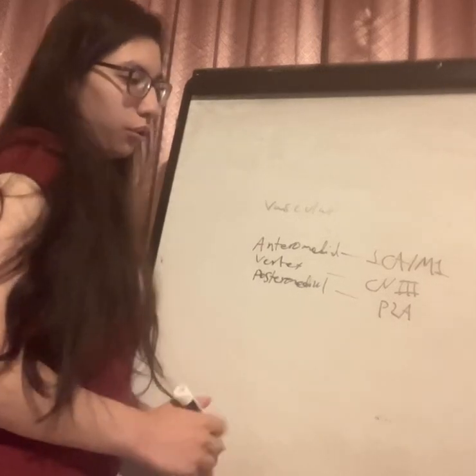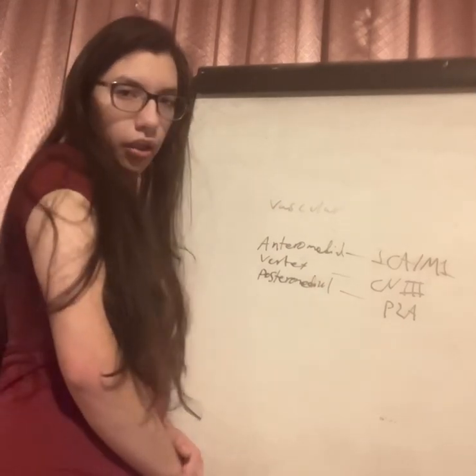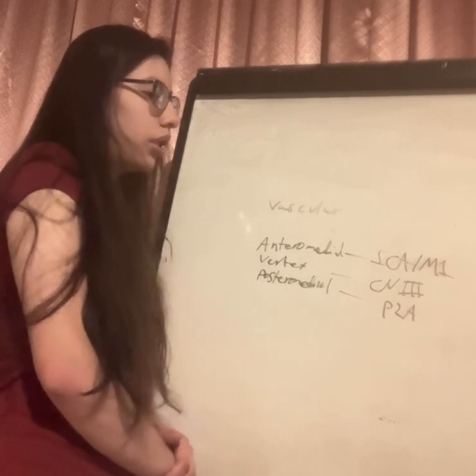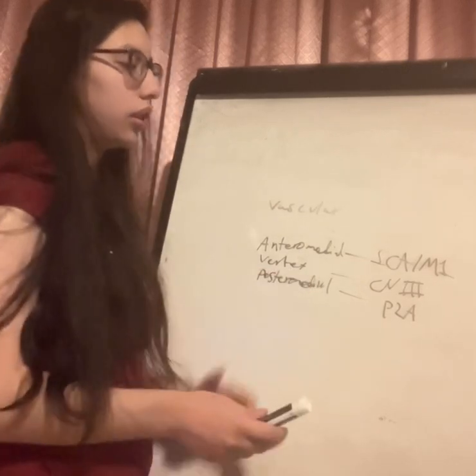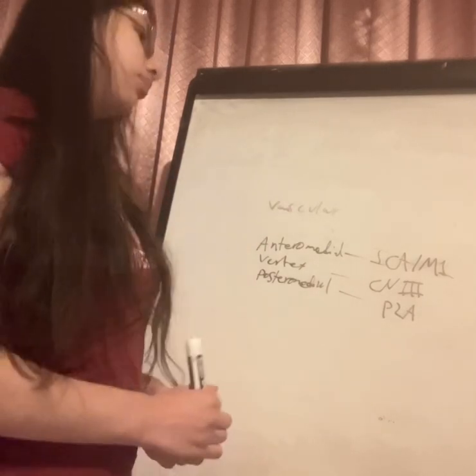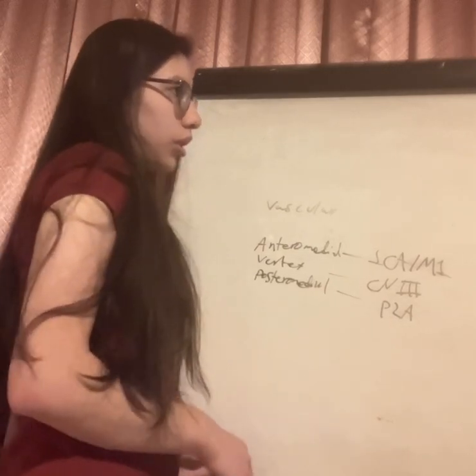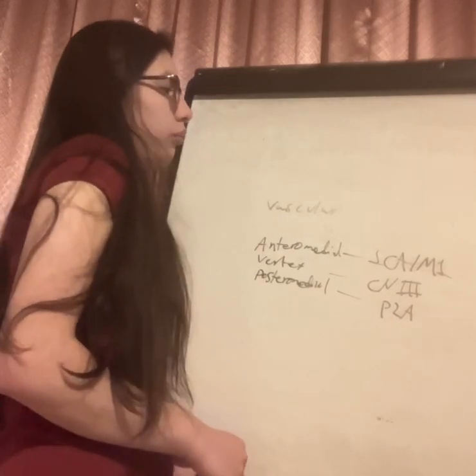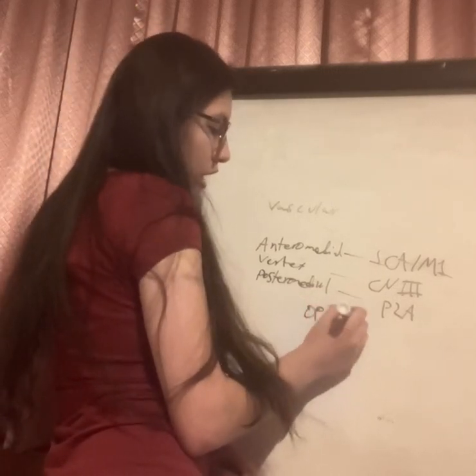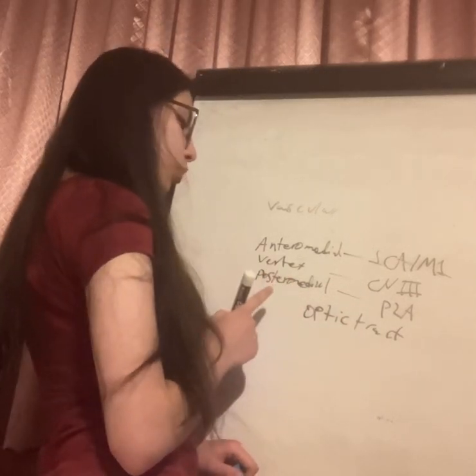The uncus is usually approached laterally when we do the anterior subpial approach. There is no clear demarcation between the amygdala and the globus pallidus above. So the key point is to find something that can tell us what is the superior margin of the resection. The best landmark would be the optic tract. However, the optic tract is not usually visualized on this approach.